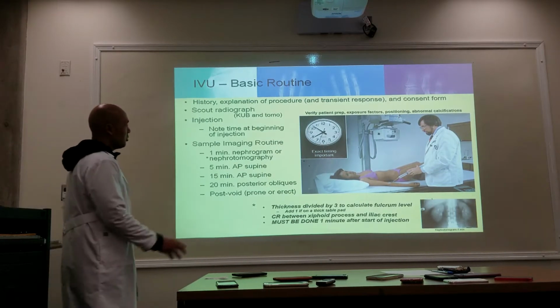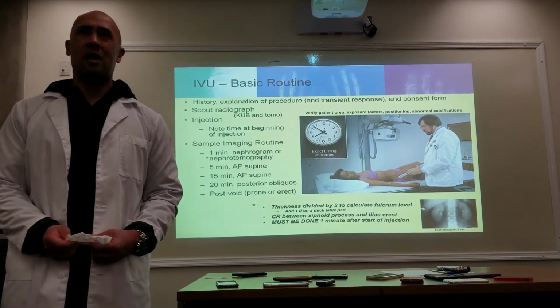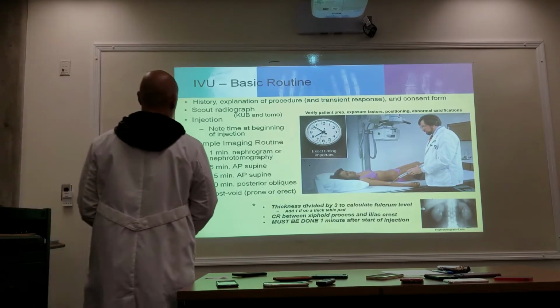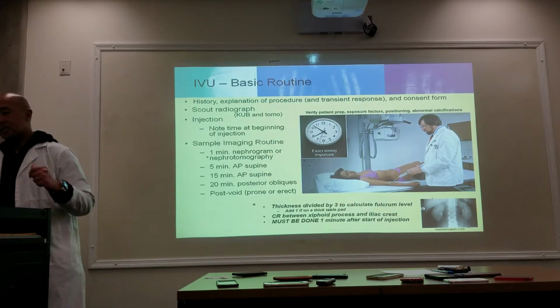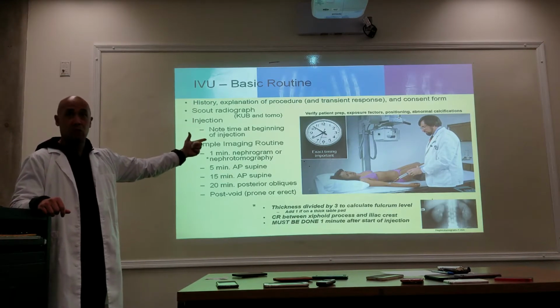Now, this is where it gets a little bit sketchy. Did Ms. Smith discuss tomograms with you? Okay. Oh man, it's going to be a lot of explaining to do. Okay, this is what a tomogram is. Because one of them is going to be your scout, is a tomogram.